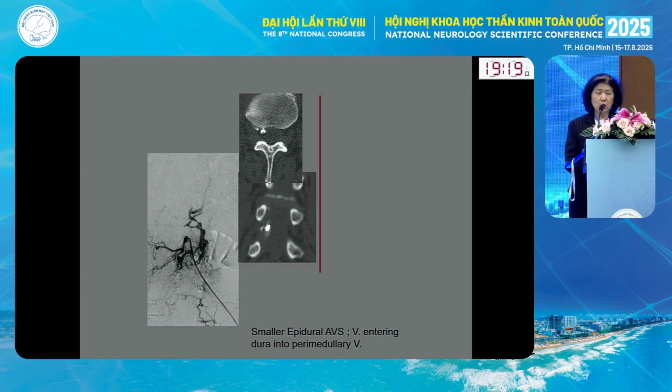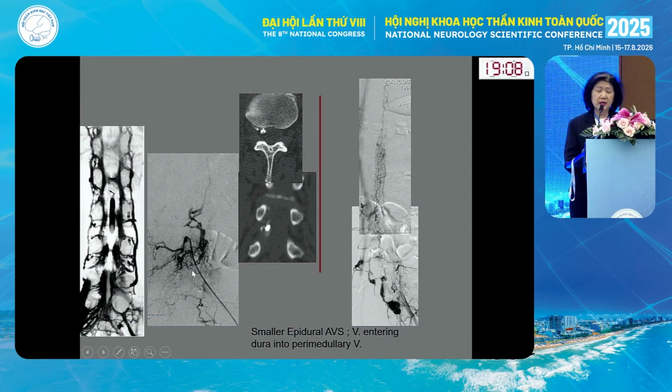Now the epidural shunt can be a small one like this. In the angiogram, you see the shunt is a strange-shaped vein. And this vein is actually part of the epidural venous plexus that is isolated or thrombosed at the proximal and distal parts. So all the shunt drains back into the dura here. This is the drainage going back. So you can have this kind of very congestive picture along the thoracic spine with this drainage, and the shunt was just outside the dura.